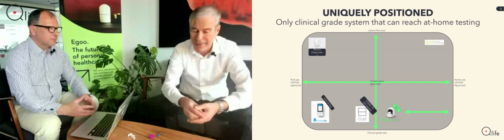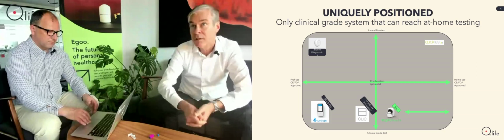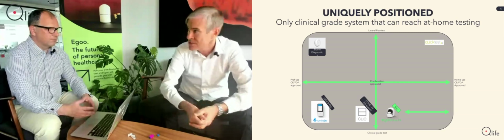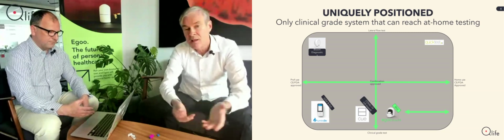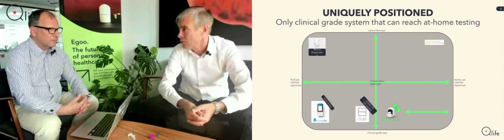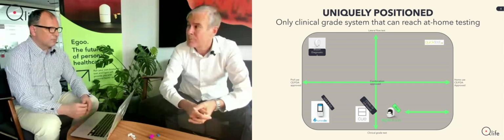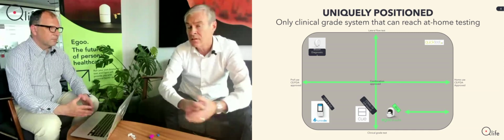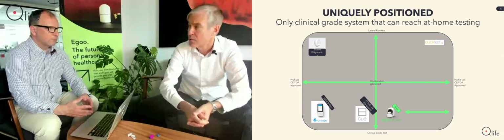Of course. There's a really bad example of someone who claimed that they could do up to 100 tests, which was the Theranos case. I think everybody has heard about it. The difference there was really that she claimed she could do like 100 tests from a drop of blood, and that's simply not possible. No. So that's one of the big differences. There were a lot of other issues, but that was a big one. And that's why, to keep the clinical sensitivity, you can do no more than 1 to 2, maybe max 3 tests in one capsule.